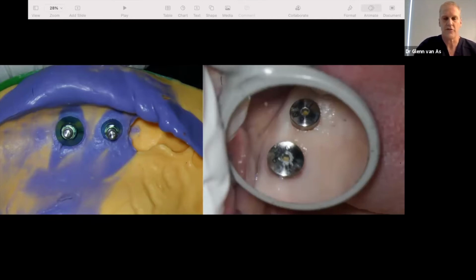And yeah, you could do it with a tissue punch. It might not be quite as clean. It might not be quite as easy to see it. You might not know that the tissue would be off the shoulder like I showed you there. But yes, you can do it with other products. But it was easy to use the laser, and that was part 1.